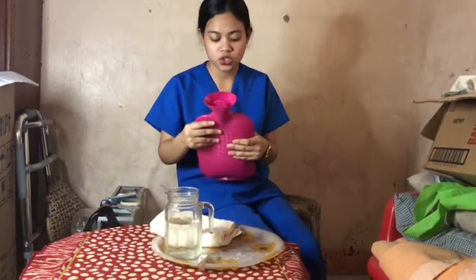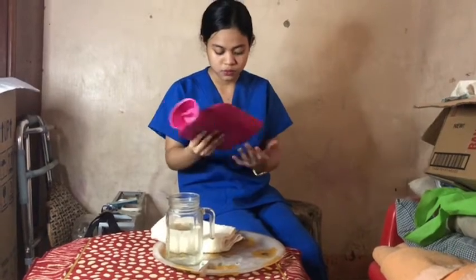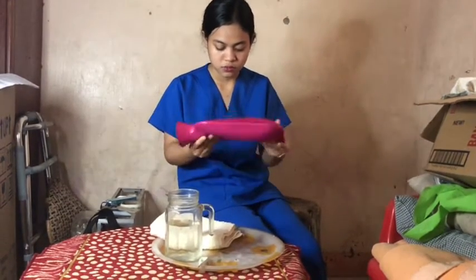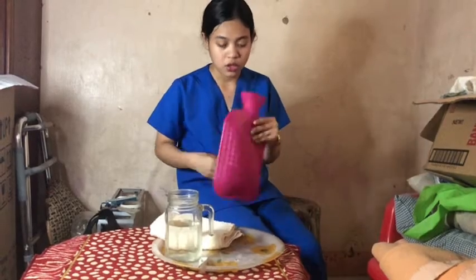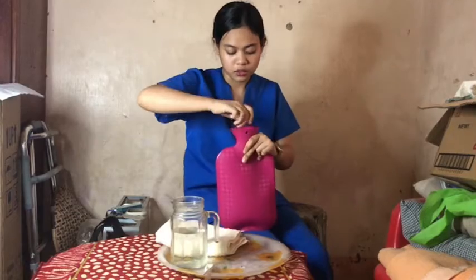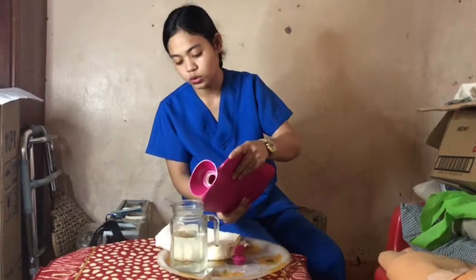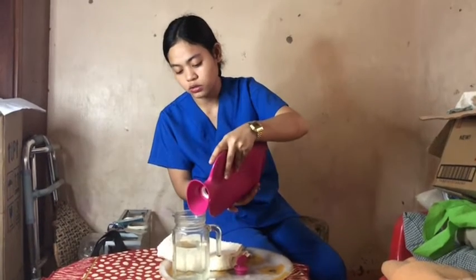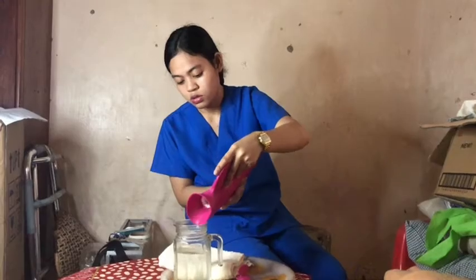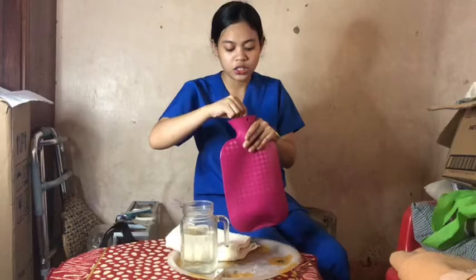Then next, I am going to check each corner of the hot water bag. Okay, as I observe, there is no presence of leakage. Then now we can remove the water from the hot water bag. So I'm going to remove the water. Let's just assume that I am removing the water into the sink of the nursing station. Okay, so this hot water bag has no leakage.